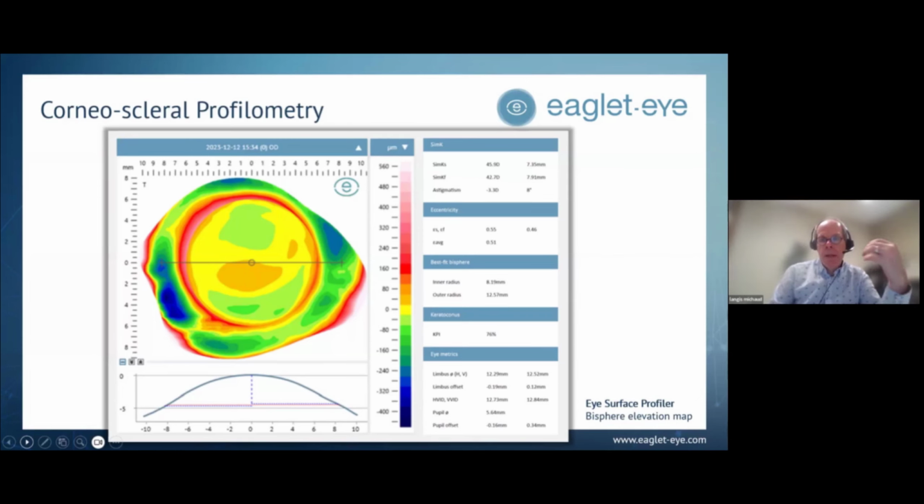For the clinician, what this map is telling us is you will have to customize your fit in order to be efficient. Otherwise, you will have a misalignment in one of the quadrants, and that may create problems, either compression, where you are too much aligned, or leaving a gap where particles can enter, and because of the suction effect, because of the subatmospheric pressure under the lens, debris will accumulate, and we may have a midday fogging issue with that kind of fitting.